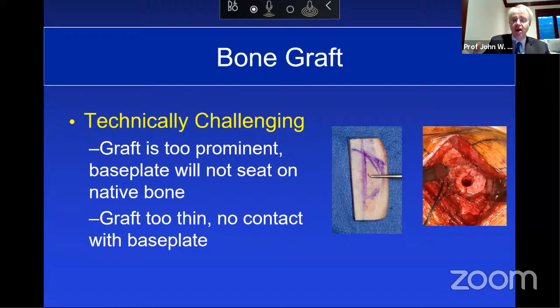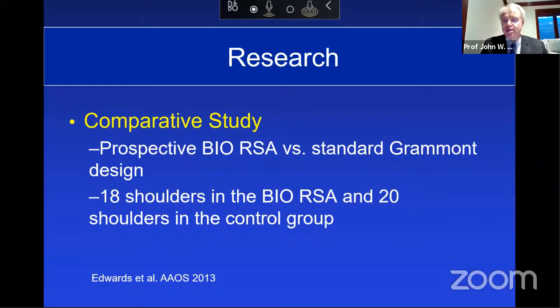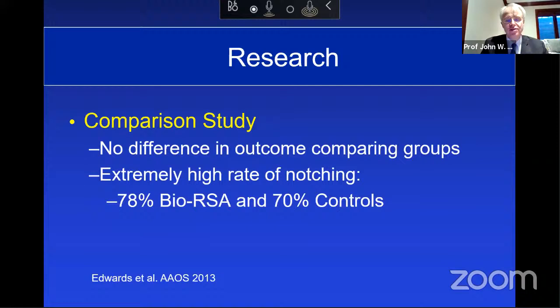This is an interesting study. This was done by Brad Edwards, who spent a year training with Pascal Boileau on the bio-RSA technique. This was presented at the Academy, a prospective study of bio-RSA versus standard RSA. And I think the things that you see with this that are starting to be recognized are high rates of notching.